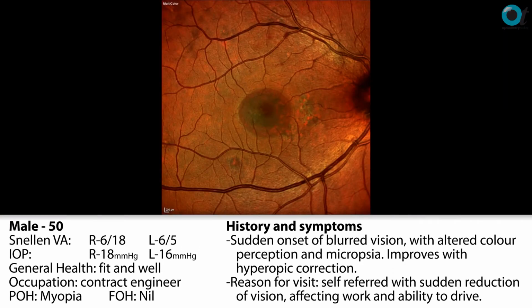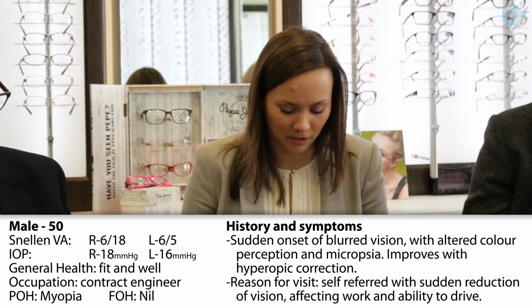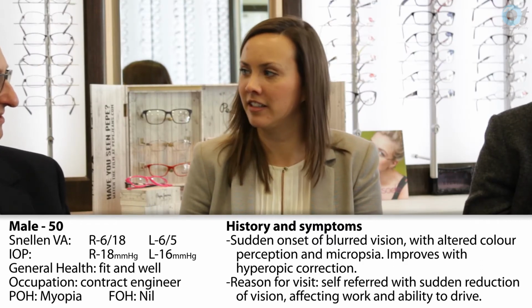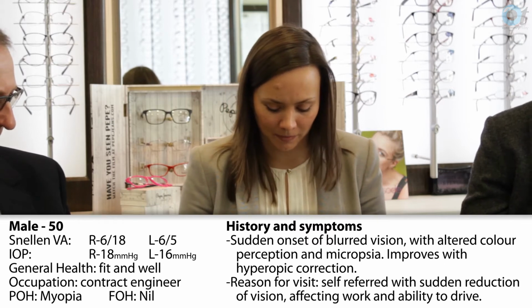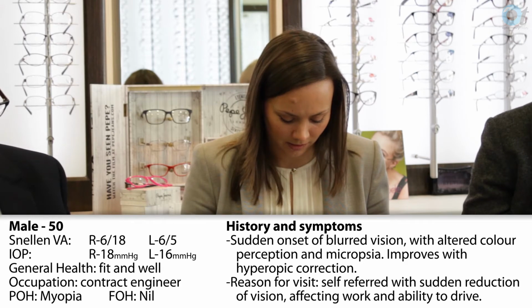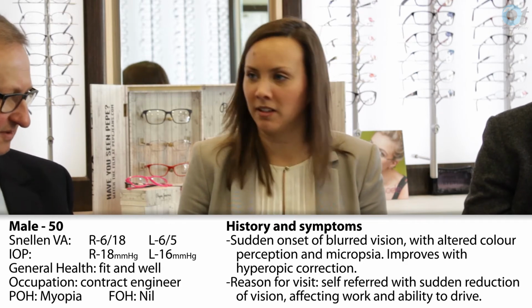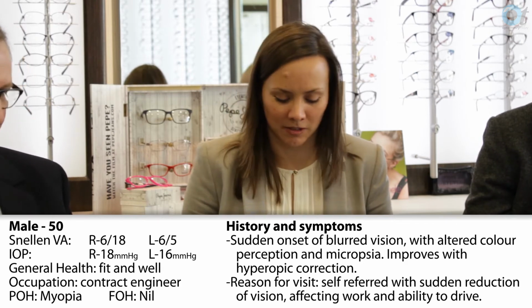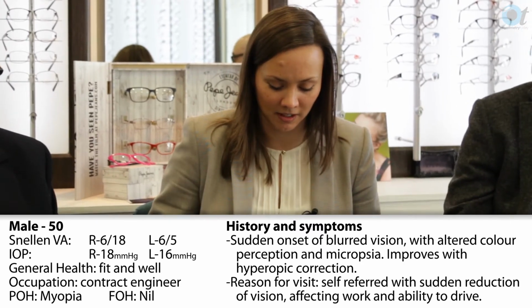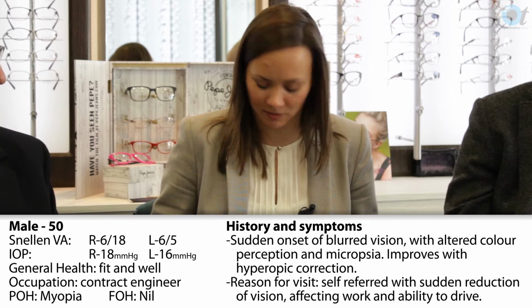Looking at the fundus reference image, there is certainly a round greyish lesion of some sort, which would be consistent with what you're suggesting, central serous retinopathy. So using that as well as the fact we have a raised area very centrally in the macula, I wouldn't disagree with that diagnosis at all. And as you say, with the age the gentleman is, he's a contract engineer, probably quite busy and rushing about, I think that sounds consistent.